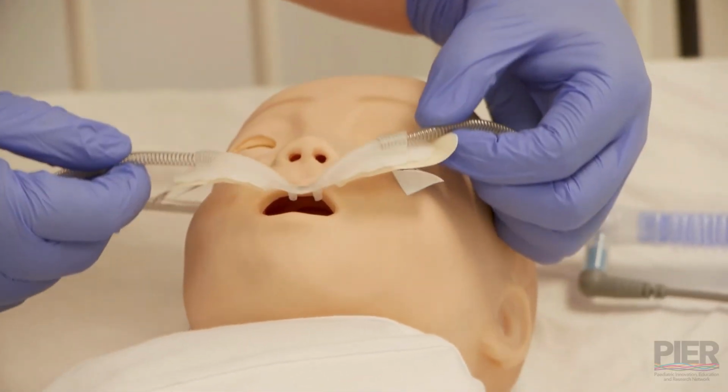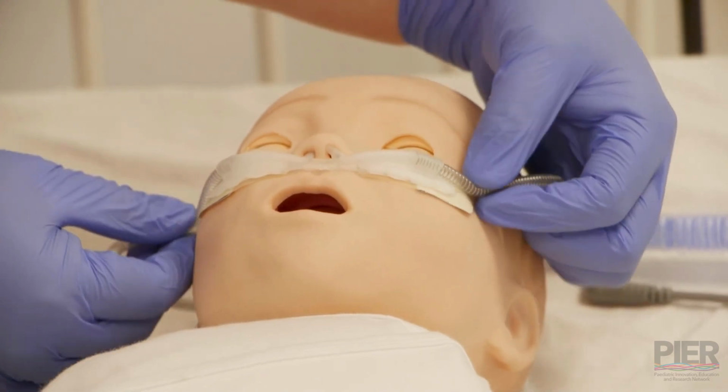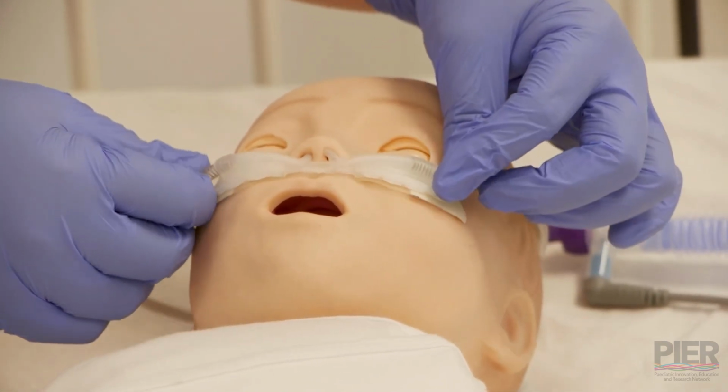When placing the nasal prongs on, if you pop them into the nostrils and then angle the sticky pads slightly upwards, it makes sure that they stay in the nostrils better.